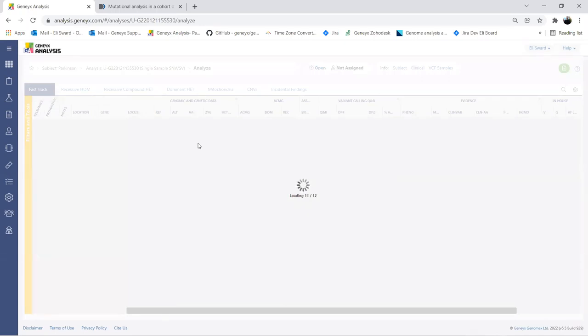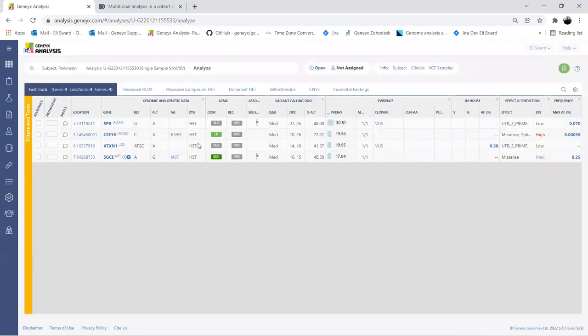The protocol in this particular workflow integrated a target gene panel. Ultimately, what we're doing is trying to identify a variant that is not observed in the sibling. With this, the gene panel identified 4 candidate variants, which are pretty easy to rule out. The first one is in the SPR gene, and we can see that this is observed in the sibling, so we can easily eliminate that.